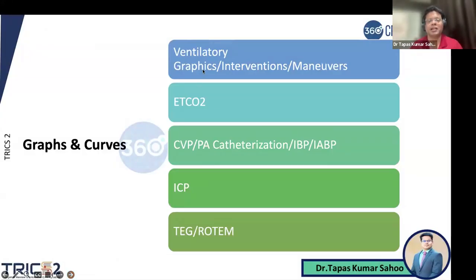First and foremost is the ventilatory graphics. Again, it is not the graphs only. They would show you some intervention and some maneuvers, and you have to identify what is the maneuver being done, what is the intervention that has been done, and what is the result of that. So that can be one of the domains.